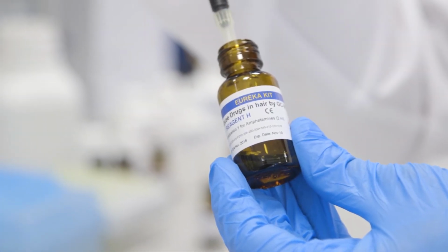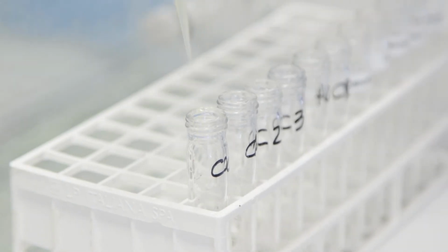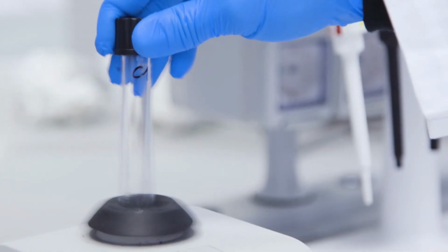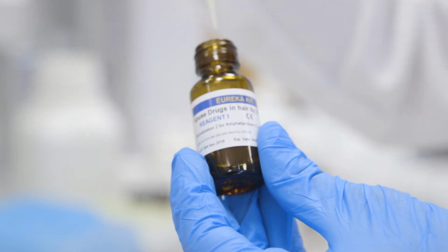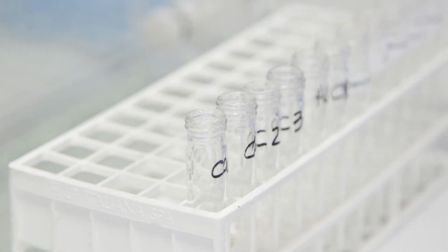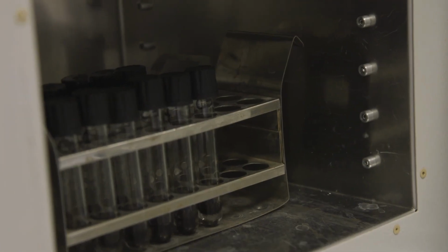At this point, add 35 microliters of reagent H, derivatization solution 1 for amphetamines. Tightly recap the tube and vortex for 20 seconds. Then put in the oven at 80 degrees Celsius for 5 minutes and let cool at room temperature. Then we add 15 microliters of reagent I, derivatization solution 2 for amphetamines. Close the tube with a cap hermetically and vortex for 20 seconds. Put in an oven at 80 degrees Celsius for 5 minutes.